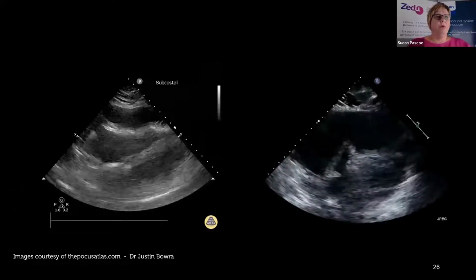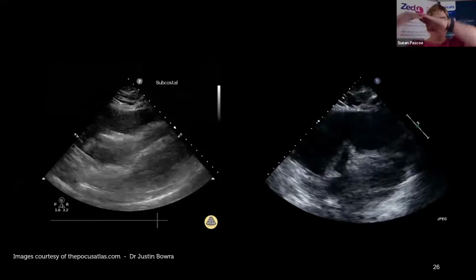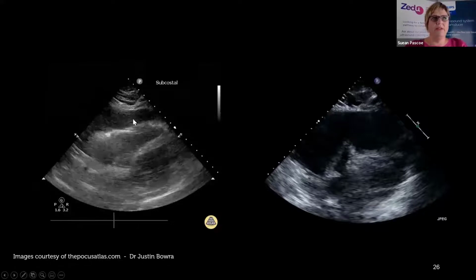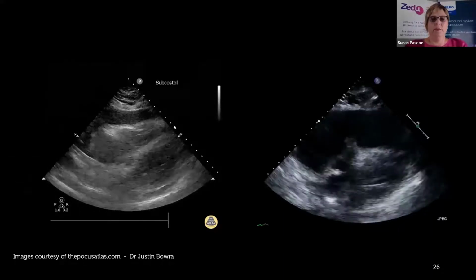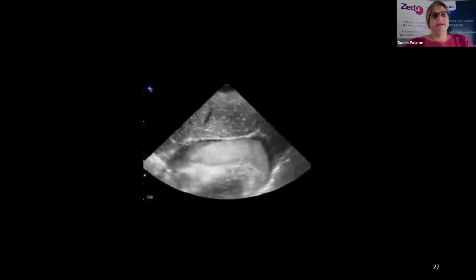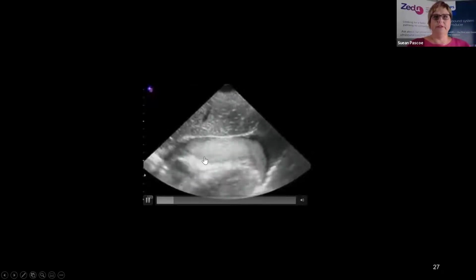And here we've got an example of a very large effusion, and now it's tipping over to be cardiac tamponade. I've seen a couple of descriptions of this. One is like the John Travolta move, with the free wall of the right ventricle doing the John Travolta. Another way I've heard this described is like someone jumping up and down on a trampoline on the right ventricle free wall. And here we have another example of tamponade. Here's another case, and sorry, this image is a little pixelly, but it's a beauty. It's a hemorrhagic effusion, or there's a big blood clot in this effusion.